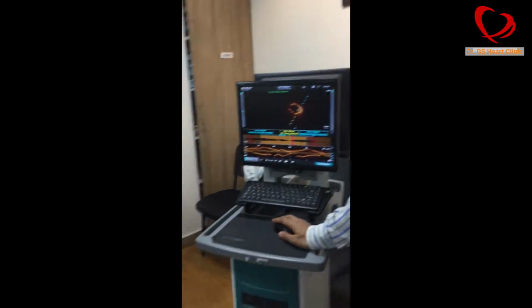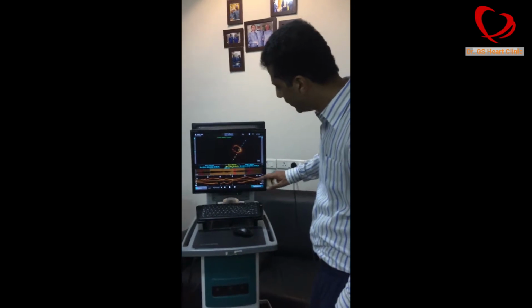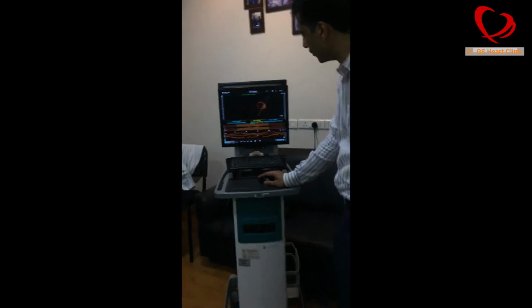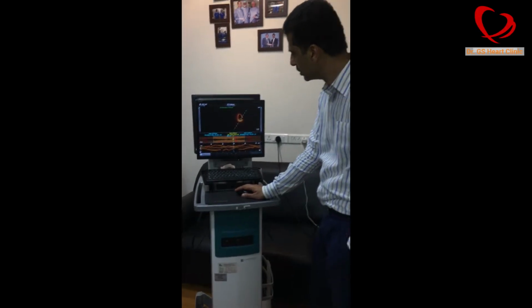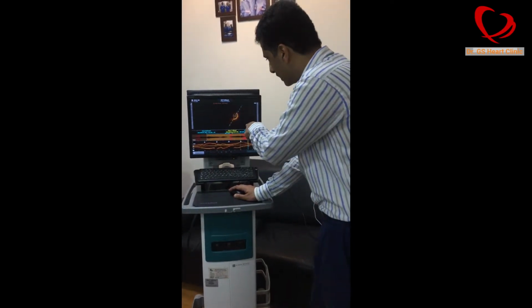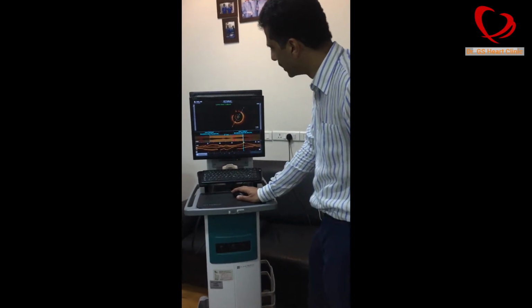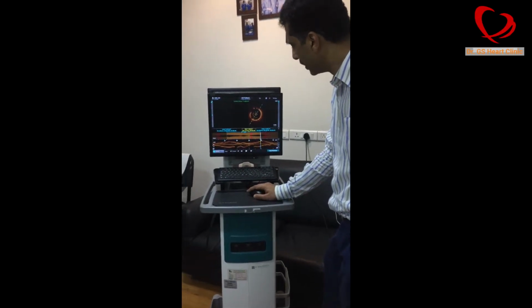If you look at the OCT, in those 3 seconds we inject dye, and quickly that one run will capture it completely. We have done it already, and now I am going to show you, from the front, the beginning to the end. This is the left main. The left main is quite big. See the left main? It's quite big. We can see it clearly. This is the catheter which I am passing. So I am going from the left main.